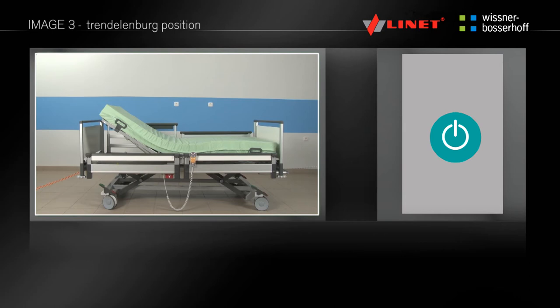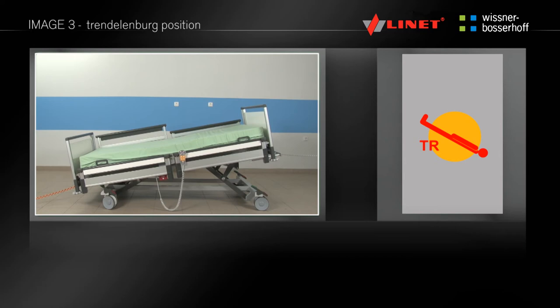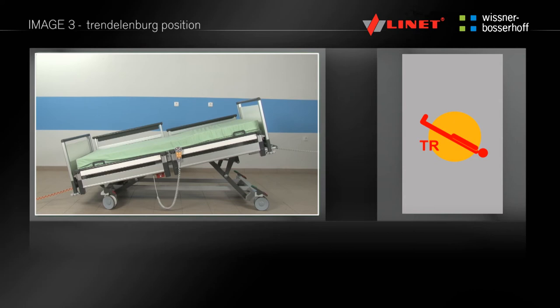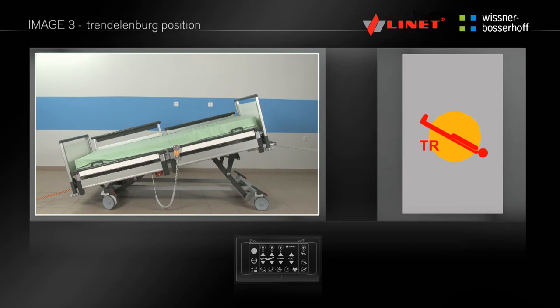To activate the Trendelenburg function, press the go button. By pressing and holding this preset button, you can set the Trendelenburg anti-shock position. The backrest and thigh rest are flattened, while the entire mattress platform is longitudinally tilted by 14 degrees so that the patient's head is in the lowest position. This function can be found only on the supervisor control panel in the area of pre-programmed functions.